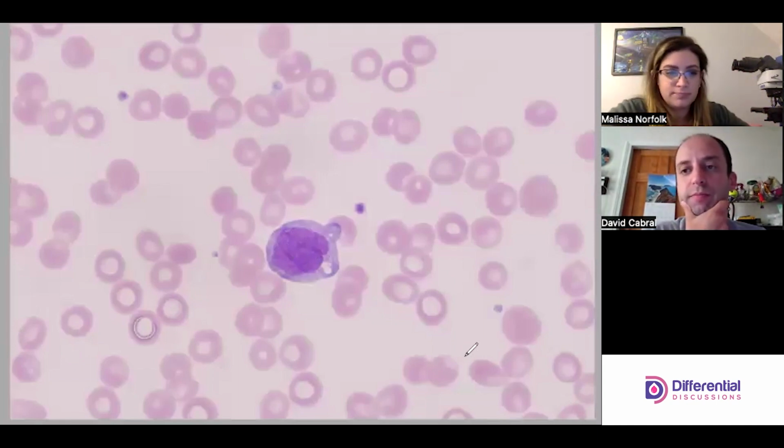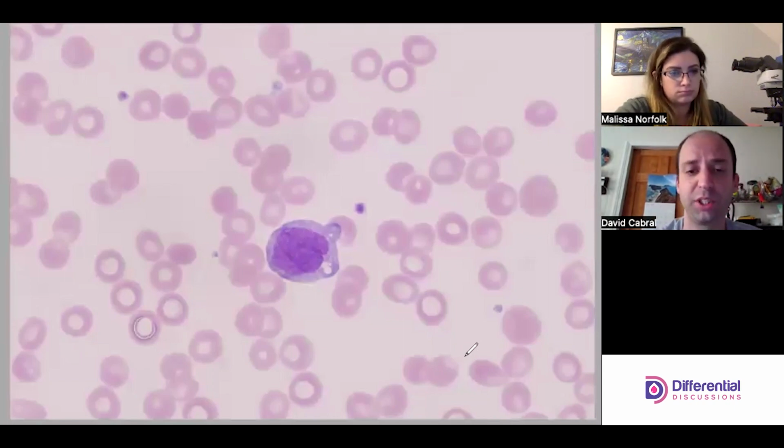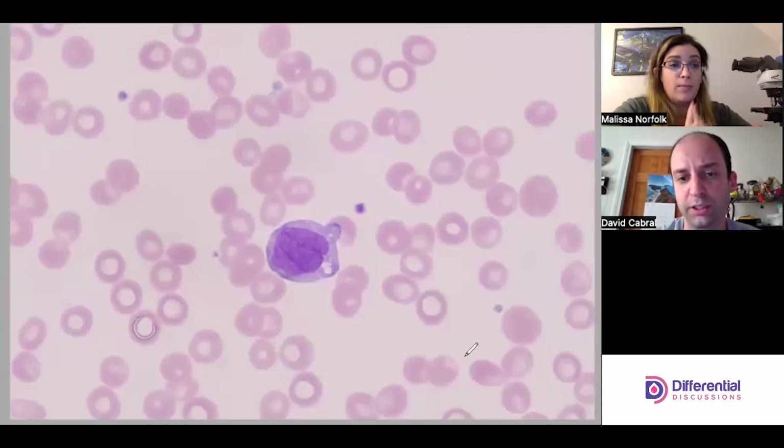The other thing too, monos are 5% or less, and often less, of the diffs that we do day to day. So we literally don't see a ton of normal monos. This one, my eye really went to that.